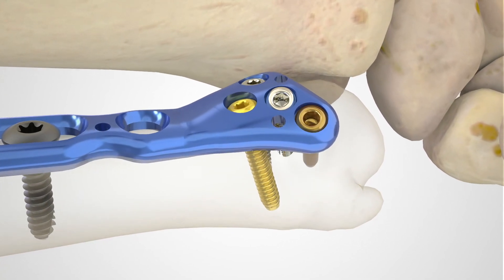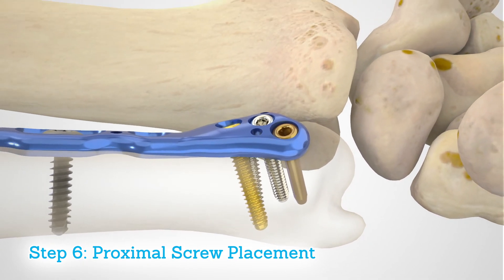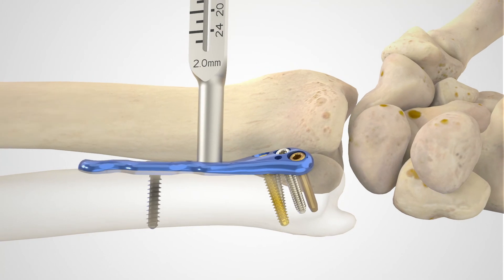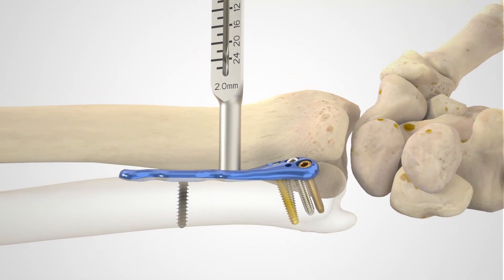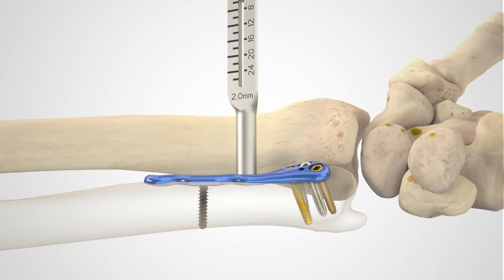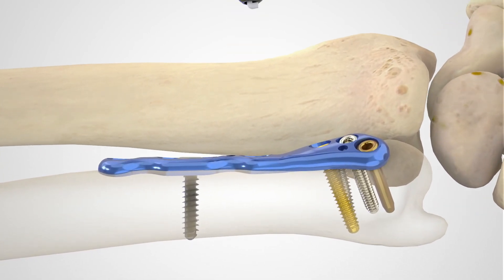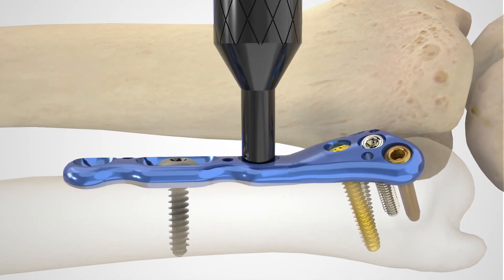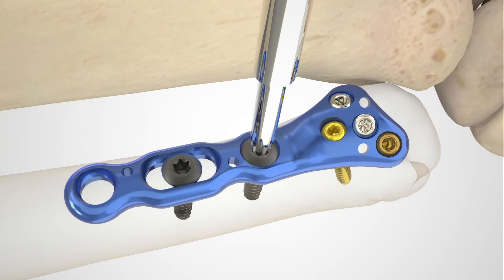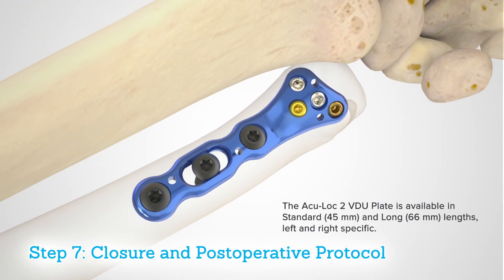The remaining proximal screw holes can then be filled with locking hex or hexalobe 3.5 millimeter screws, or the 2.7 millimeter low-profile hexalobe screw. Insert the appropriate threaded locking drill guide, drill with the appropriate quick release drill, and measure with a depth gauge. Take care that the screws do not exit the bone dorsally. Perform a thorough radiographic evaluation checking fragment reduction, alignment, and screw placement.